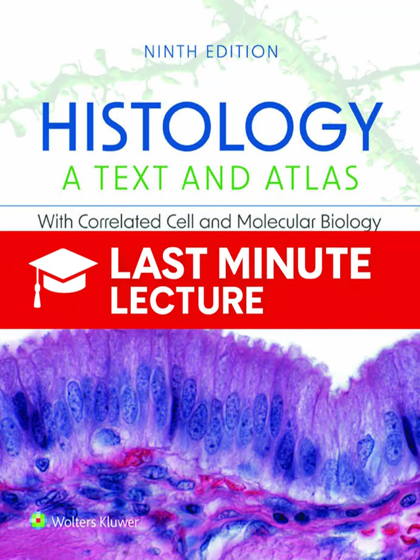So what's the real significance of the Feulgen reaction? I mean, why not just use hematoxylin to stain the nucleus blue? The significance is that it's quantifiable. The reaction with the Schiff reagent is stoichiometric, meaning the amount of magenta color produced is directly and mathematically proportional to the precise amount of DNA in that nucleus. This makes it perfect for quantification. And crucially, RNA, which has ribose instead of deoxyribose, doesn't stain at all.